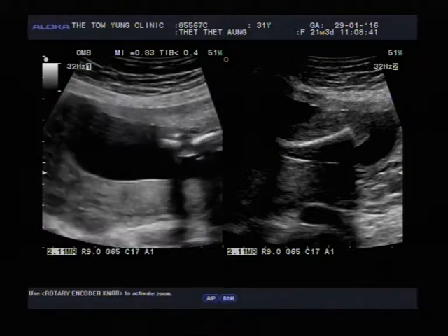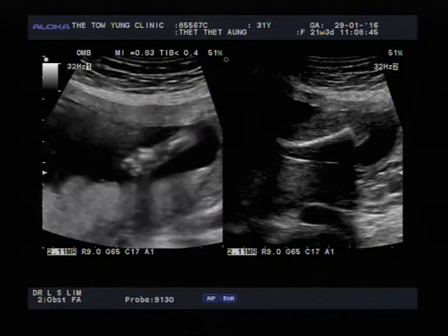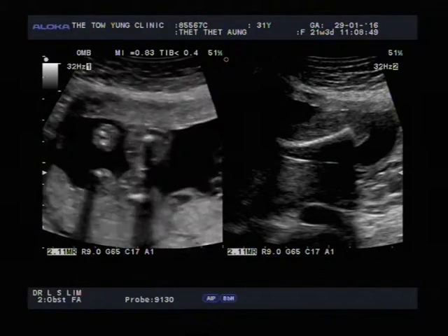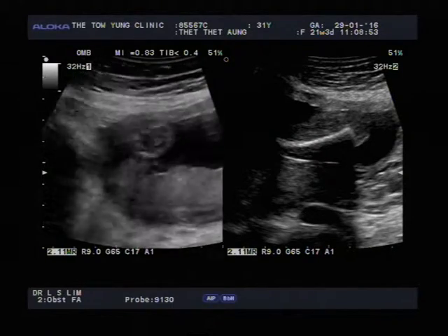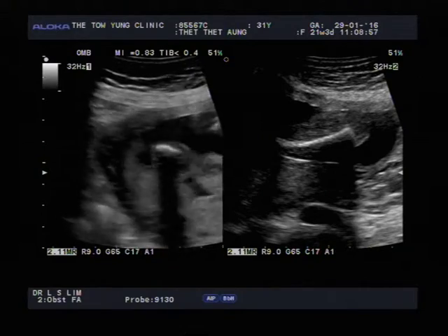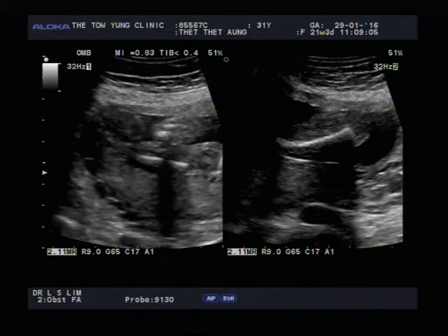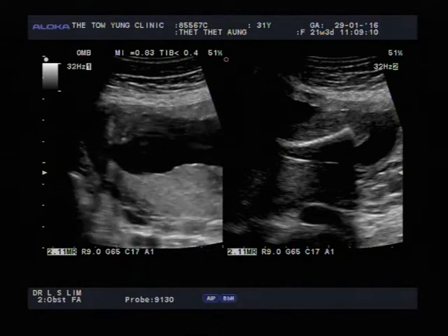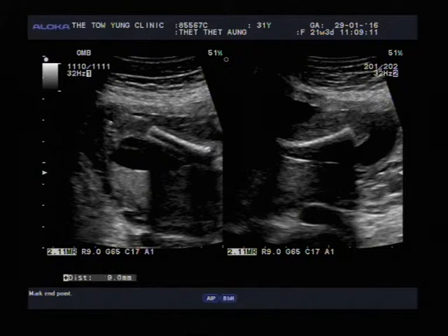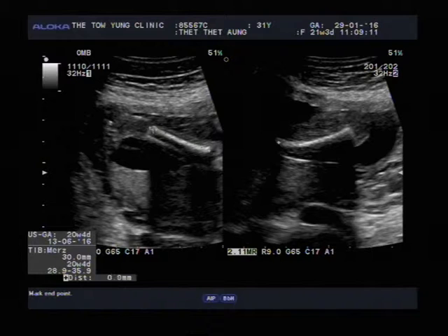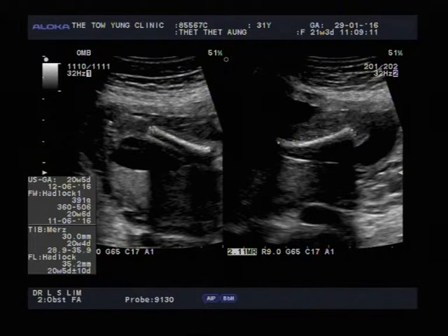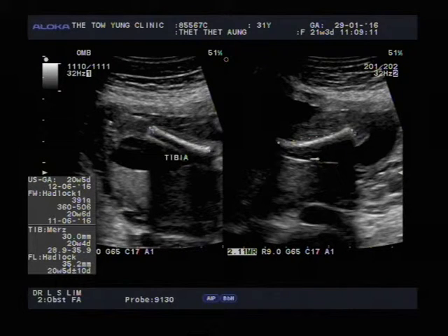Let's look for the baby's legs — there are always two bones. There's the leg — you can see two bones in the baby's legs. The baby is really moving so much. The anterior medial bone is called the tibia and the lateral bone is the fibula. This medial bone is the tibia and it measures up to 30 millimeters. The femur was measuring up to 35 millimeters. Both bones are within normal measurements. I'm going to write down the names — tibia and femur.